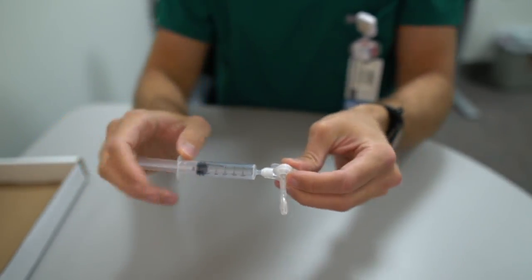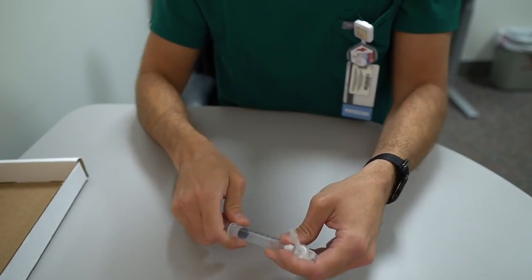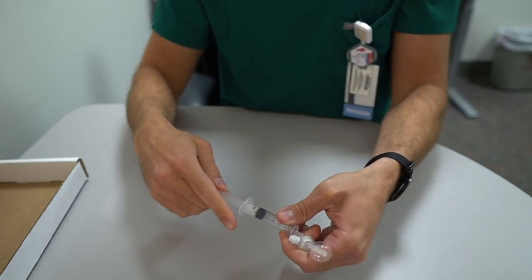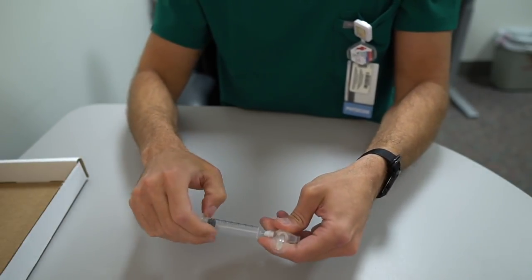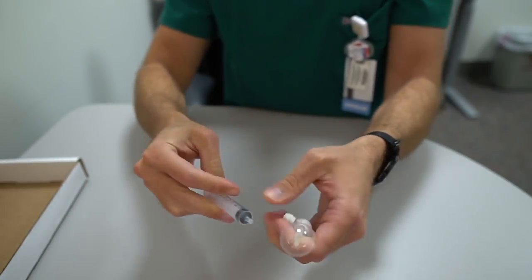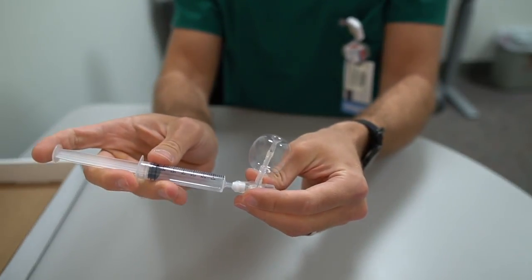All right, so here we go. I'm just gonna keep doing this. This is about 6 cc's. I'm gonna do 5 cc's so we keep it. So there's one. Problem is every time I put this in, it actually deflates a little bit.